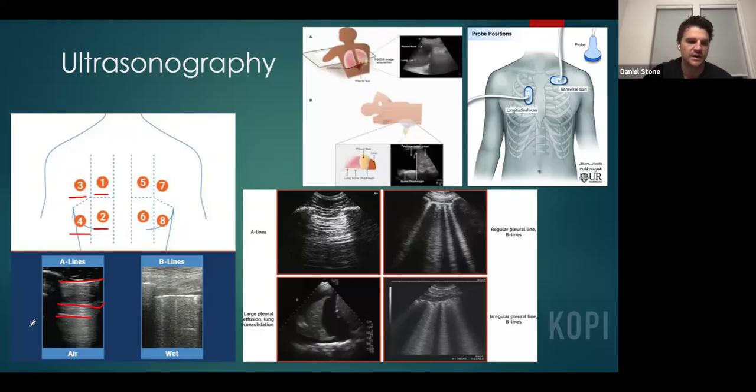So when the ultrasound is shot down, the ultrasound machine shouldn't necessarily interpret anything. And when it doesn't see anything, what happens is it creates an artifact called the A line, which just basically means that it's a double interpretation of the actual line that it's visualizing here.